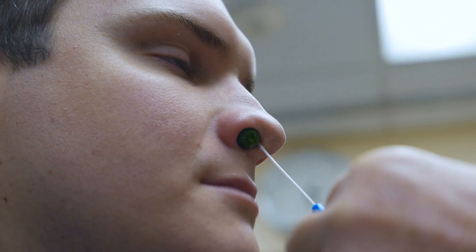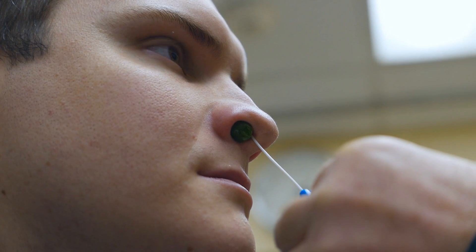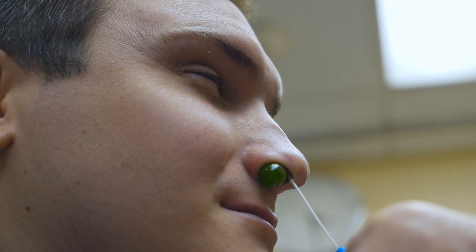I want you to tell us how much discomfort you're having. I think I'll go medial first, and if you're having a lot of discomfort, you tell me. It's not that painful — I can just feel it touch them. That tickles. Okay, I can feel it inflating. There we go.